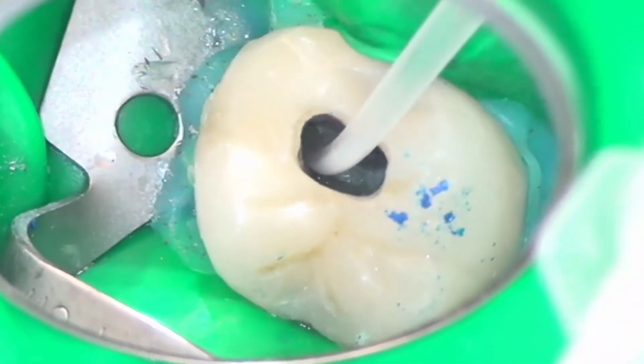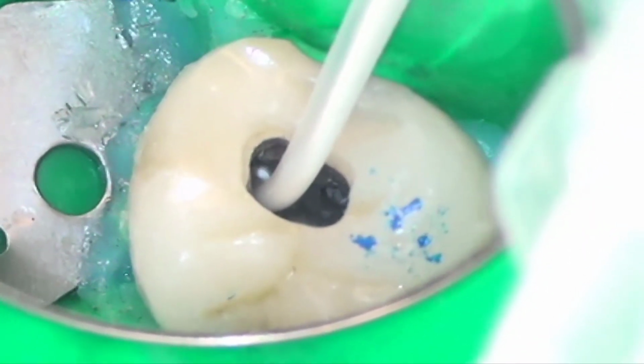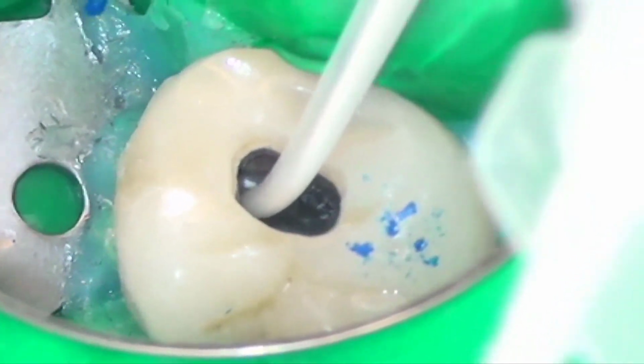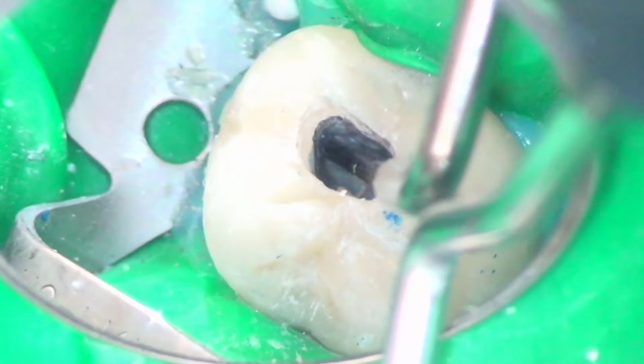A bioceramic sealer or cement is distributed to the canal system with a syringe. The root-filling material of gutta percha is then heated and condensed to conform with the internal canal anatomy.